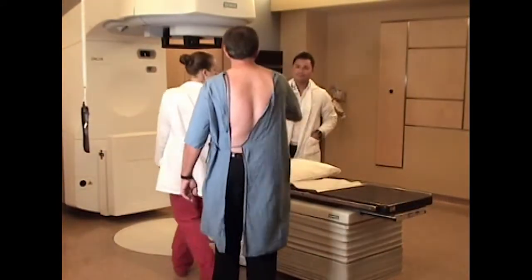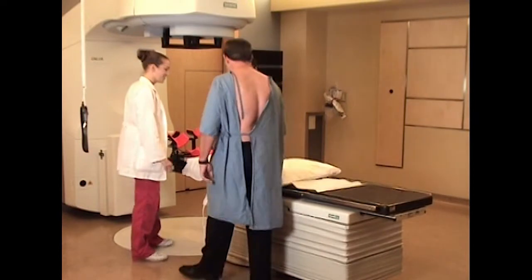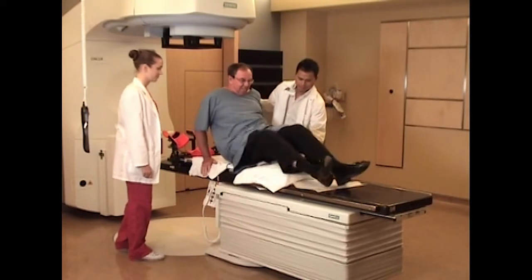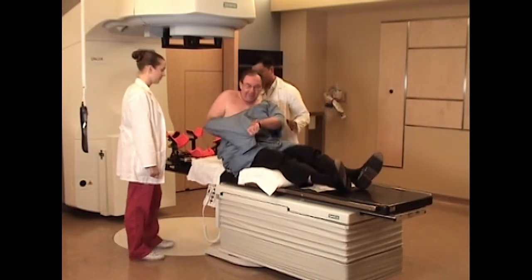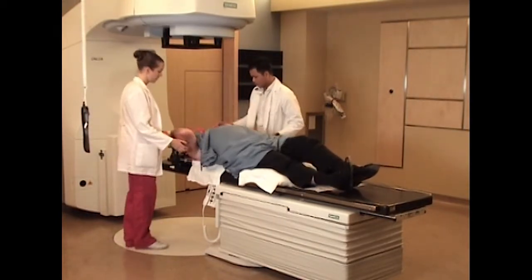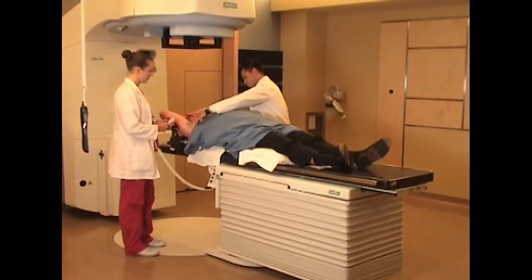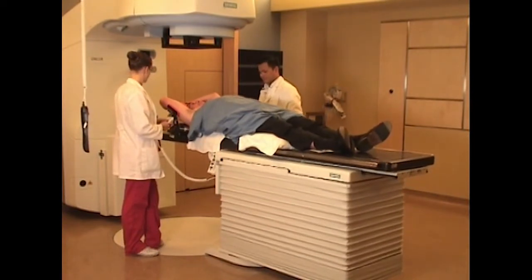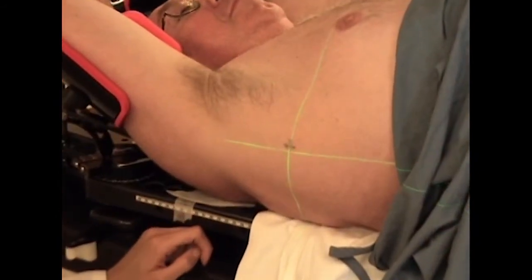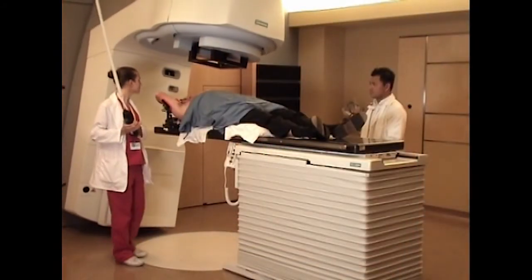Upon entering the treatment suite, you will be asked to confirm your identity by providing your birth date. This is to ensure that your treatment information is displayed in the treatment room. The therapist will help you into the exact position you were in for your simulation appointment. They will use the appropriate positioning devices as required for your particular treatment site. The couch will be raised, and the radiation therapist will align the machine and take measurements. Your position will be checked against your treatment plan and tattoos. The machine will move as part of the setup, but it will not touch you.